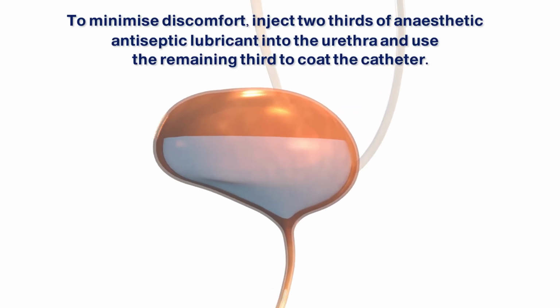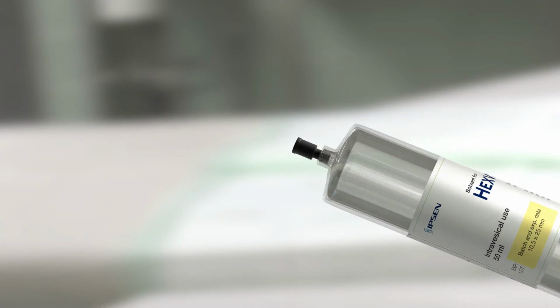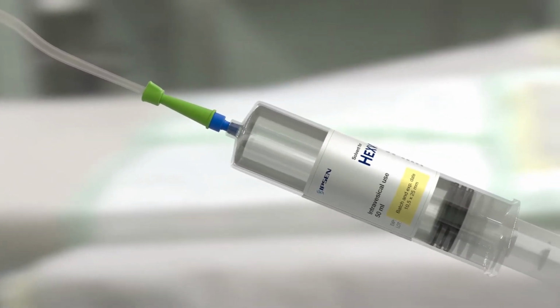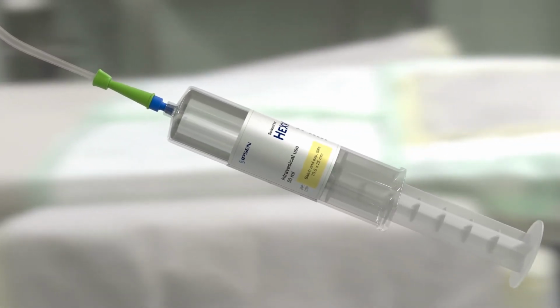The patient should be catheterized and the bladder completely emptied prior to the installation of Hexvix. After catheterization, connect the Luer-Lock syringe containing Hexvix to the catheter using the Luer-Lock catheter adapter and gently instill the entire 50 ml volume of Hexvix into the bladder.